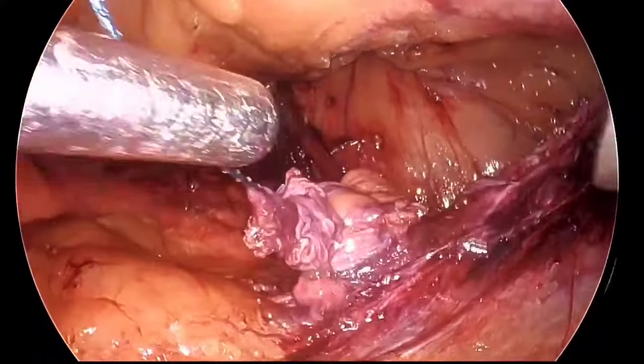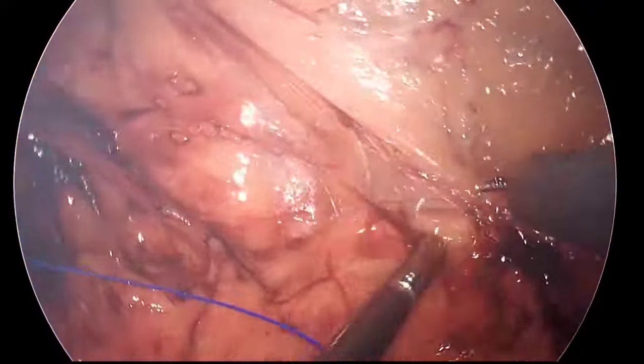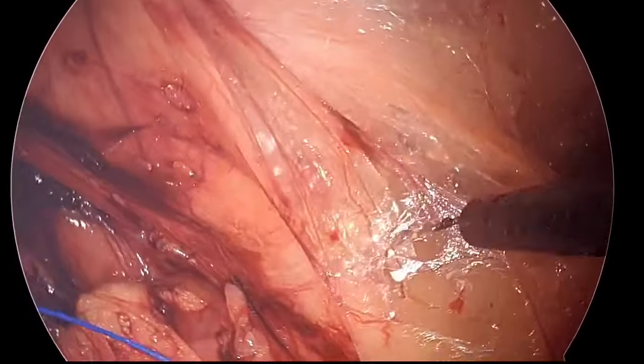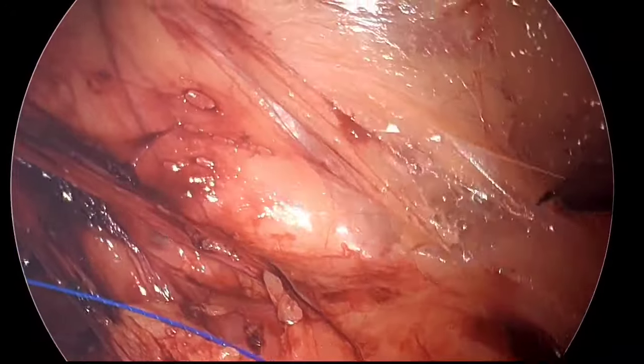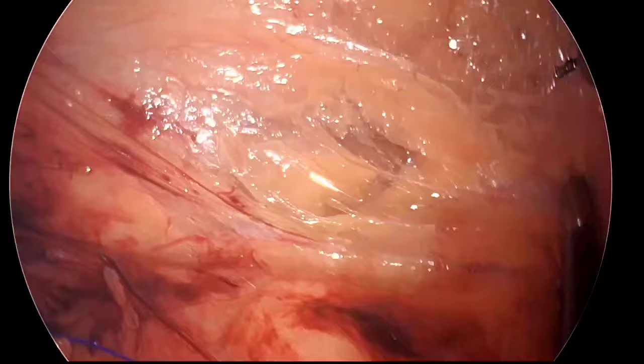But this is the first time I'm using an eTEP approach for a groin hernia, particularly for this case where I anticipated prolonged and complicated dissection.